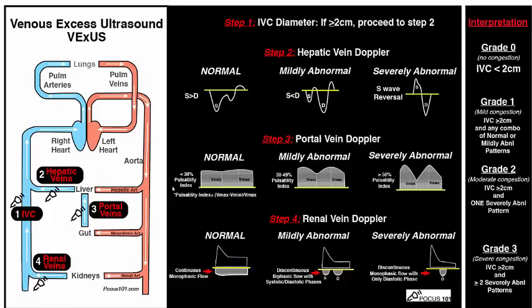Okay. What is the venous excess score? Think about the venous excess score as an advanced level of assessing systemic venous congestion. A dilated, non-collapsing inferior vena cava will give the first clue. But is this dilated inferior vena cava and increase in right side pressure reflected in the systemic organs, the gut, the liver, the kidney? Is it reflected or not? Exactly like the left side pressure: you may diagnose a left atrial pressure increase, but does this increase cause pulmonary congestion and pulmonary edema?